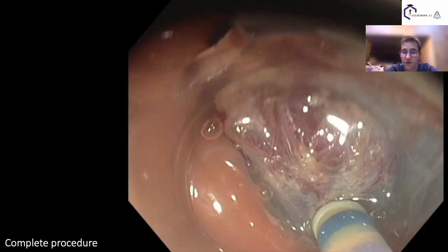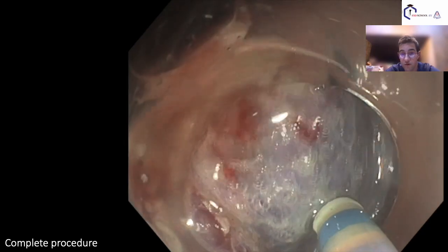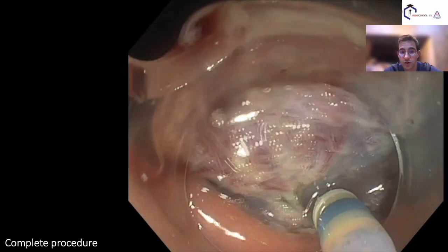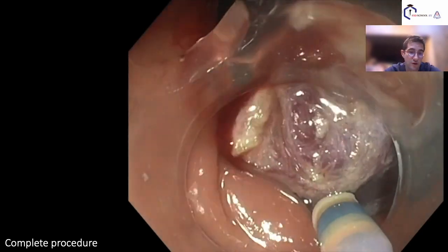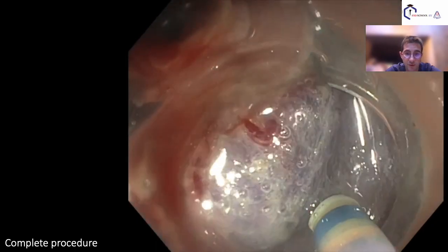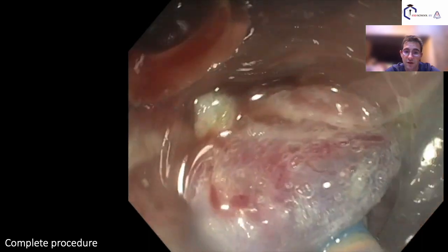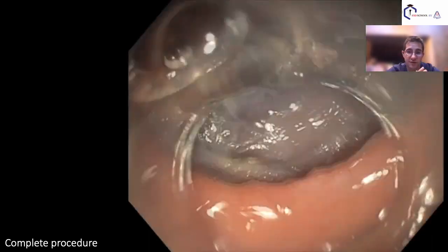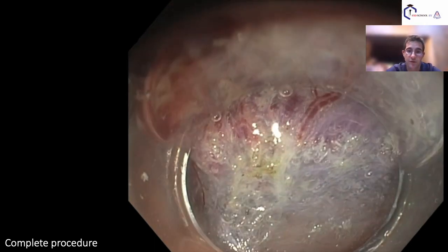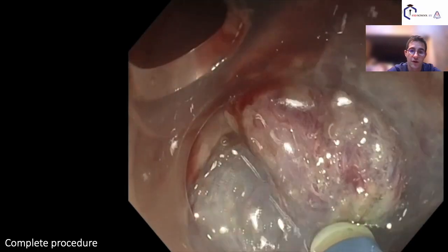And the other benefit of being relatively deep is that you have a deep margin, so it's better for malignant lesion. Here we don't think that it is a malignant lesion, but it's better to have more margin from the vertical point of view. And the last point is that vessels come from the deep part of the muscle, and after they divide in many branches. So the deeper you are, the fewer vessels you will have.